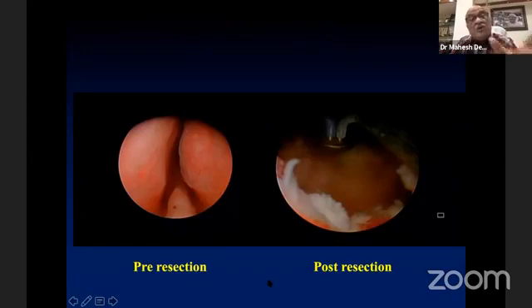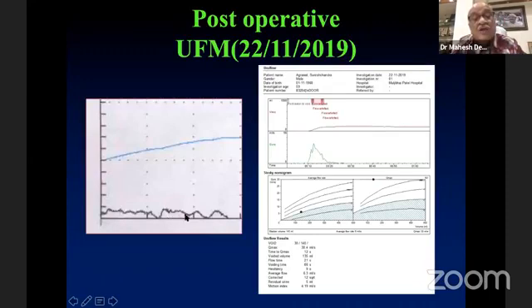And the most important thing to remember is, once you remove the transitional zone, the peripheral zone will expand. So the radiologist afterward will say the prostate size is the same. The patient will come running and say, Sahib, you have not removed my prostate. But actually, as you explained to them before, the transitional zone enlarged, and that is removed. What you see is a channel cavity, and that is the most important for flow. But still, the proof would be your uroflow.